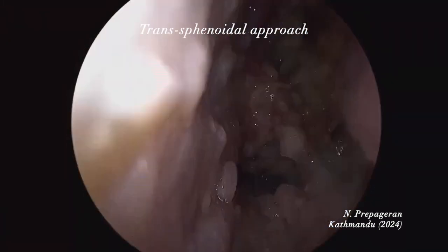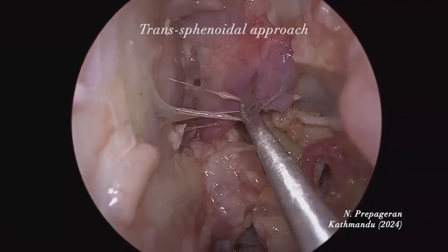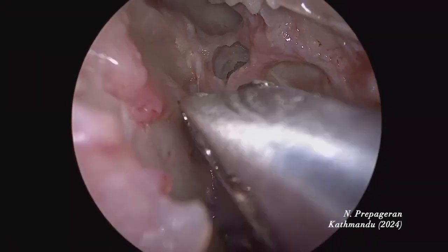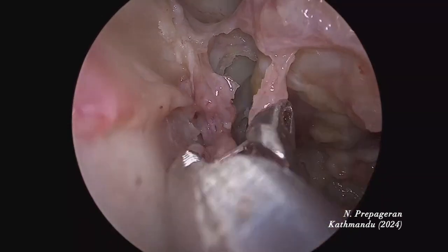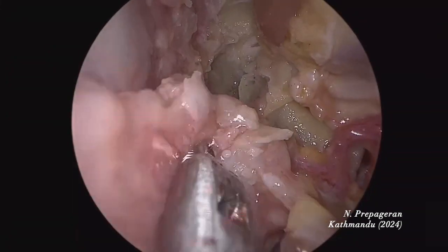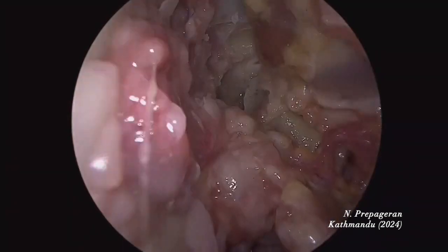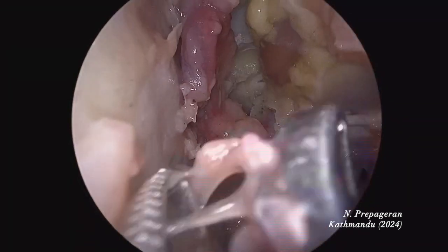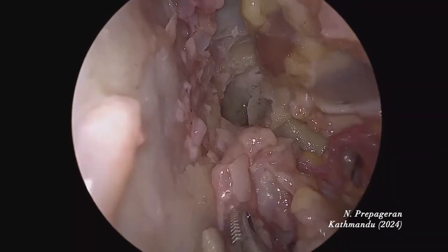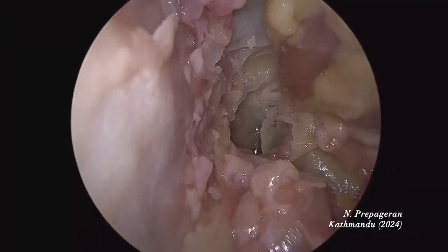Let's go on to the skull base dissection. First, I want to cut the middle turbinate on both sides. When you cut the middle turbinate, you don't dissect the entire turbinate out — you keep the posterior attachment intact so the blood supply is maintained. This becomes a middle turbinate flap. Now we have a middle turbinate flap as well as a septal flap, and a nice view of the sphenoid.